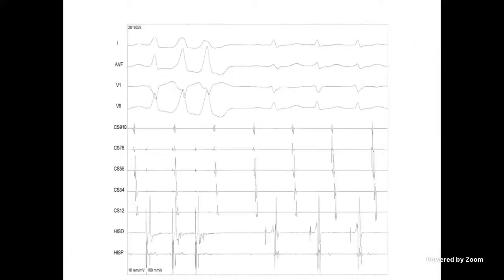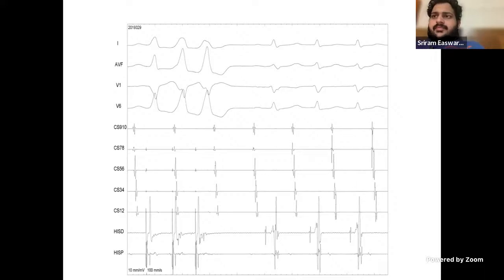The other thing which Aditya was also showing you: when you look at the atrial channel, look at the regularity, it has not changed, and the activation pattern also has not changed. It has remained the same. Look at the way it is going.